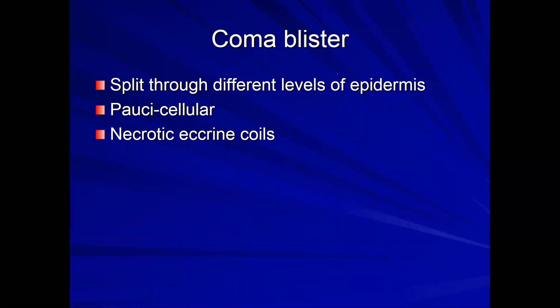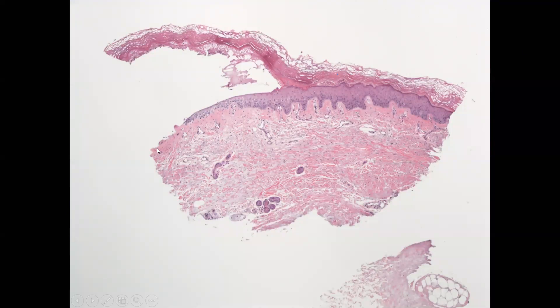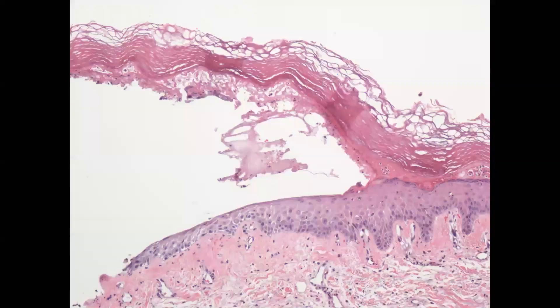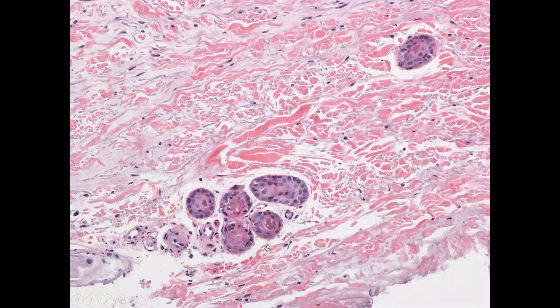A coma blister results from lack of perfusion — not autoimmune or inflammatory — so it is paucicellular. The key finding is necrotic eccrine coils pointing toward ischemia. The blister splits through multiple different layers — subepidermal, intraepidermal, and up through the cornified layer — making you suspicious of an outside-in process or ischemic event. Here you can see the ischemia to the eccrine coils: unhealthy-looking epithelial cells with fuzzy colors and purplish specks, indicating non-viable eccrine epithelium.